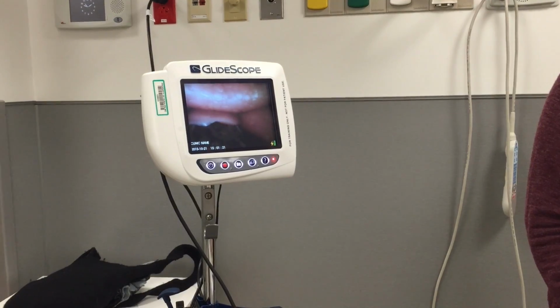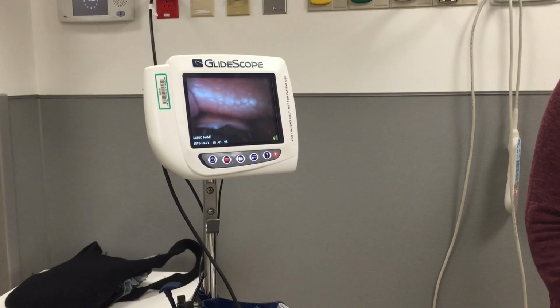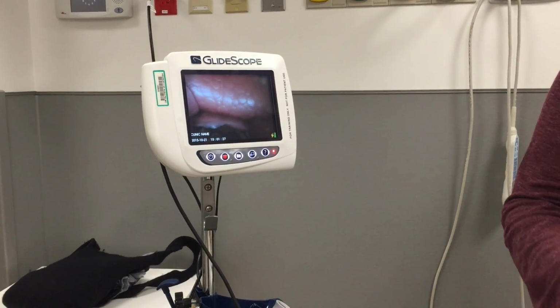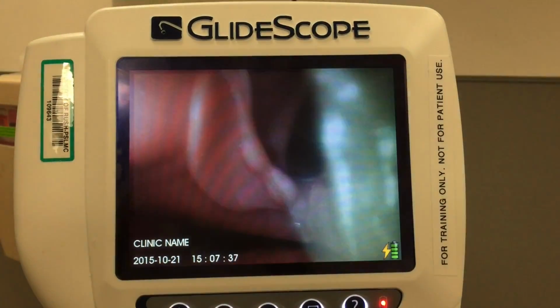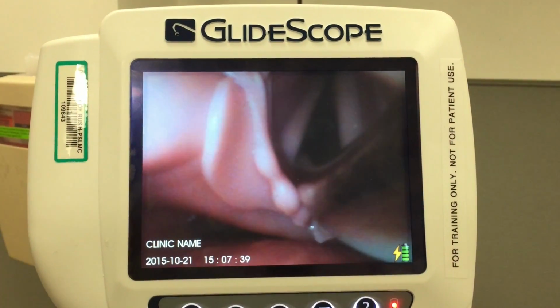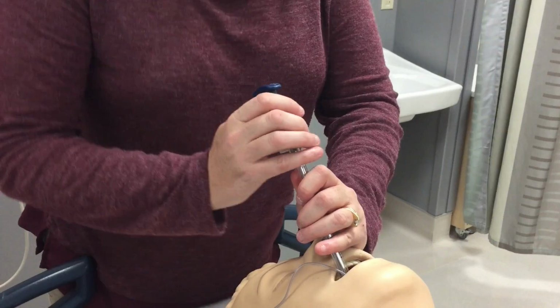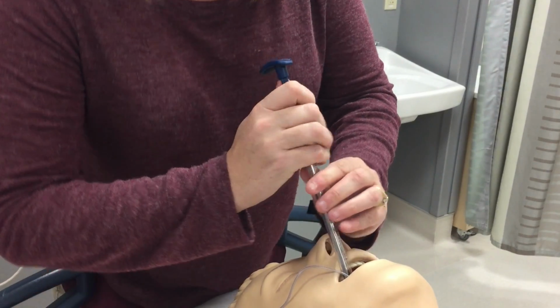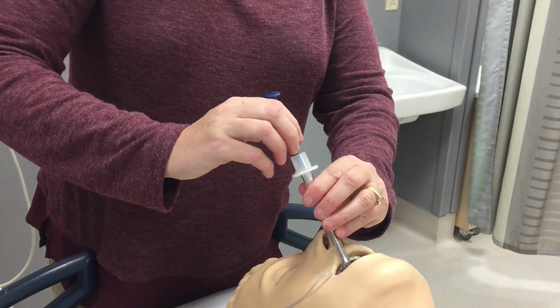When you see that, you want to pull out just a little bit and crank back, and then you will take your ET tube and direct it into the patient's airway. Once you see the balloon go past the cords, you will pop the stylet just a little bit and advance the tube.